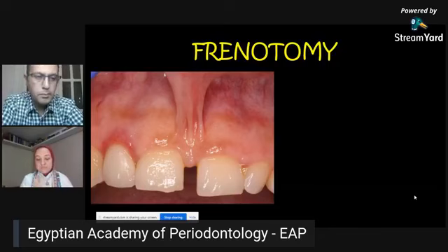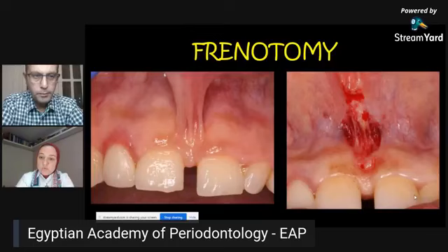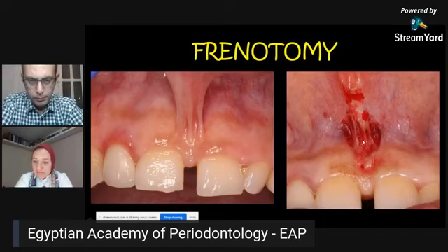This frenum, as we said, is really challenging. When you open a flap partial thickness, you can see the reflection of the trifid frenum here. You can see the three insertions, strong and high insertions of the muscle. So we go partial thickness, a C shape like this, and a C shape like this, and join the two incisions together in a partial thickness manner. Once you join them, you see this. You can see the muscle insertion very clear and very strong.